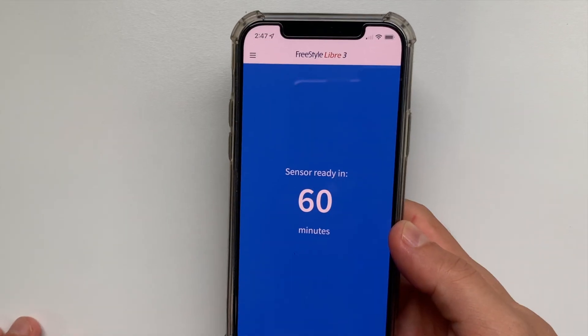The beep starts a 60-minute warm-up period. This is a perfect time to set your alarms, your ideal range, and look a little bit closer at the sensor design.